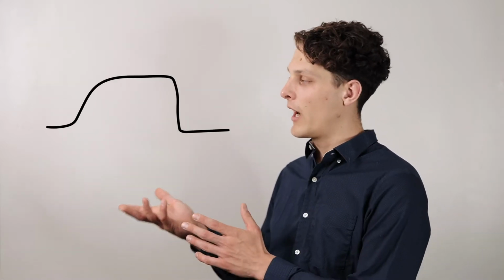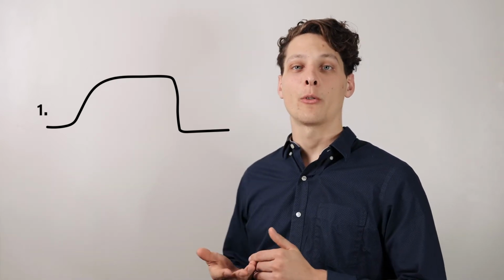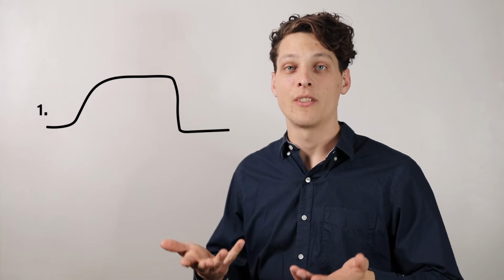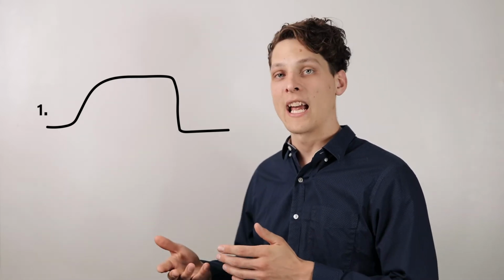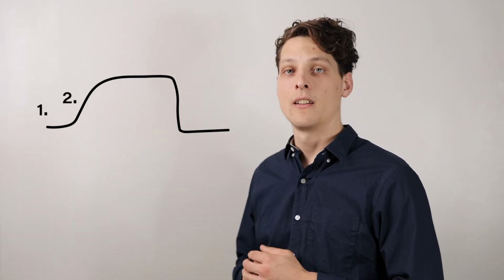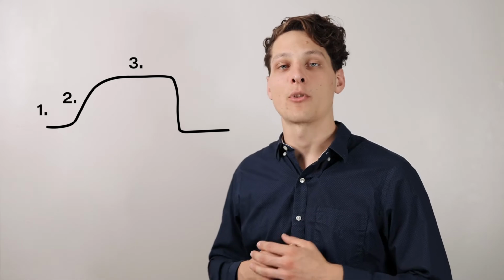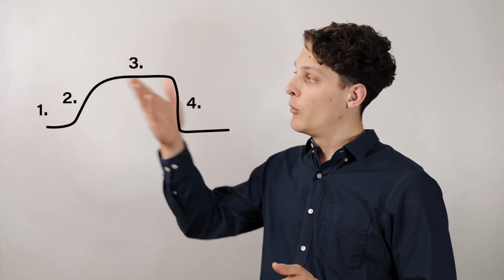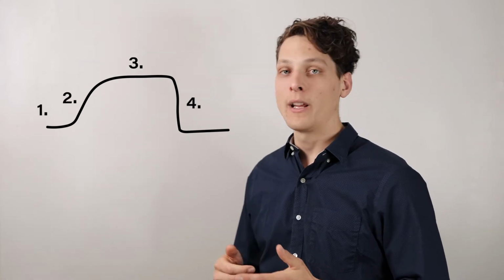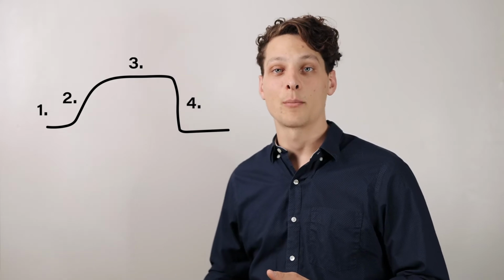A normal capnograph starts out at a baseline of 0 with a horizontal plateau that represents the expiration of dead space. As soon as there's a mix-in of alveolar gas, we see a vertical rise. After that, there's a horizontal plateau during the expiration of pure alveolar gas. Finally, there's a maximal point where we get our end-tidal CO2 value, and then it drops off at inspiration.